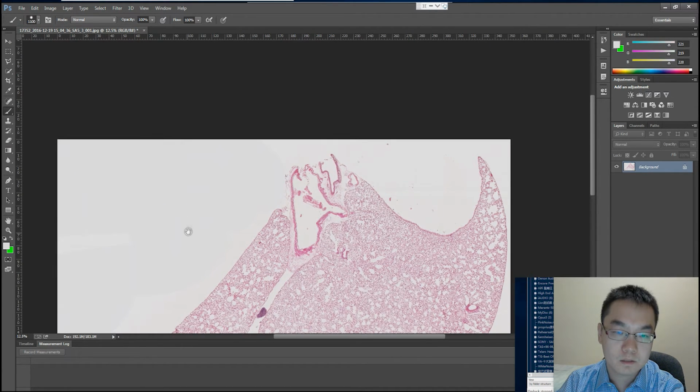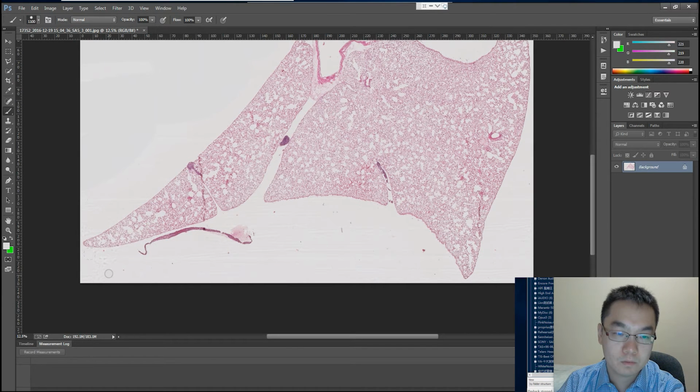Let's just move around more. Okay, here on the bottom. Also, there is another trick. If you are trying to go straight across, after you finish here, hold down Alt key and go where you want it to end, and then hold down Shift key and press the left mouse button. That helps you to go clear all the way through. It's just gonna save you some time, some trouble.